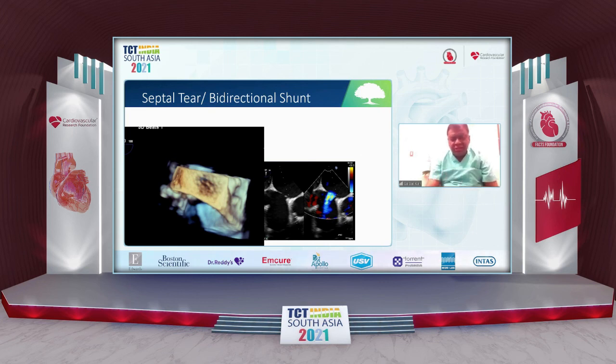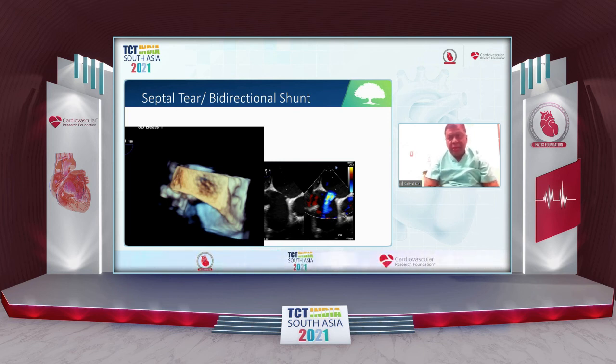Yeah, in most cases this may be tissue degeneration in the older patient, but usually it is in the first 1 month. And then, of course, effusion is important. And then mitral stenosis, you can always prevent it by measuring the gradient after each clip attachment. So you attach the clip and you measure the gradient. And if the gradient is not too high, then you can deploy the clip. So be careful before, because once you deploy it, there's no coming back.